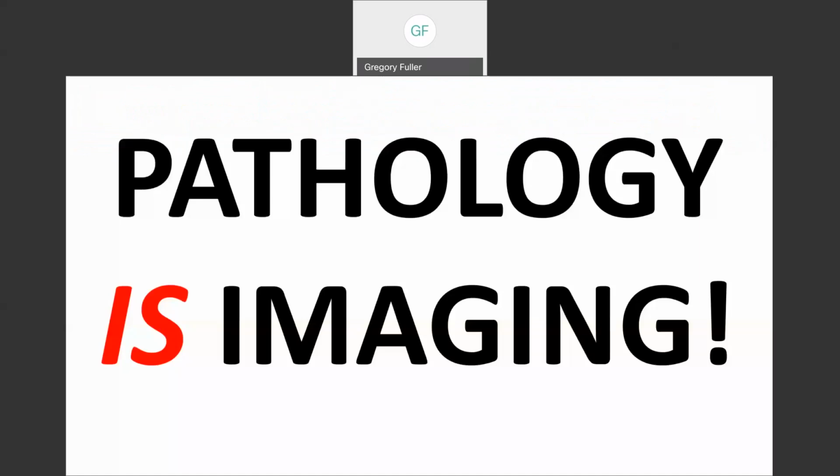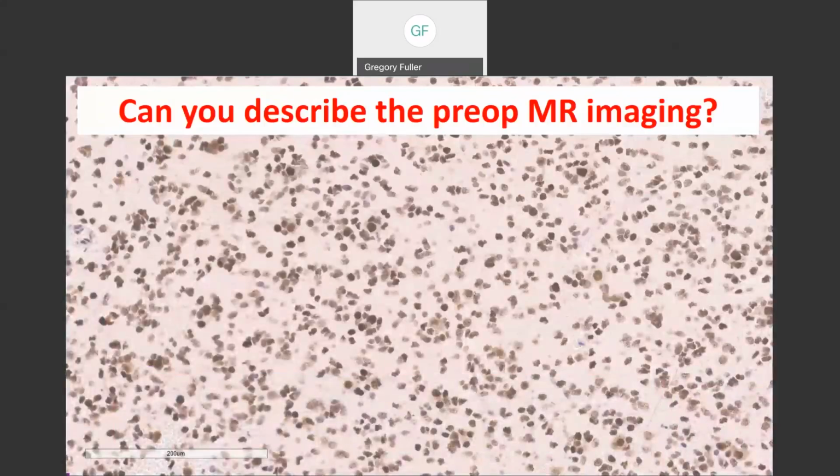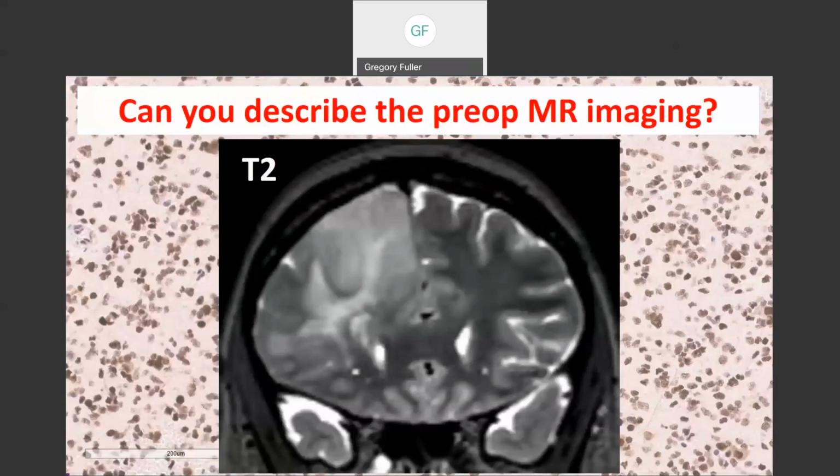So listen, when an oncologic neuropathologist looks at this slide, do you know what he or she sees? This. We see diffuse infiltration, that's right, Dr. Cathcart, T2 hyperintensity infiltrating from the white matter into the cortical ribbon, blurring the gray-white junction. All right, so we're talking up here in this area.